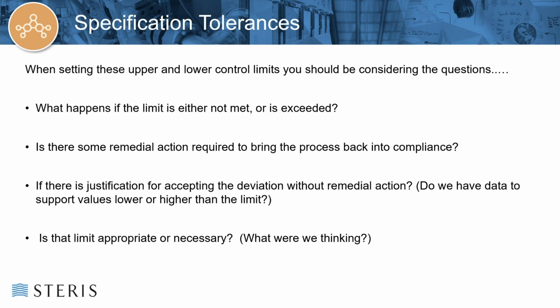Or do you have graphs that show if the product is cold, how long does it take it to heat up to the desired temperature before it can be removed? You want to make sure that your preconditioning timestamp was not exaggerated when you set the limit to start with. You want to make sure that you understand the minimum amount of time necessary for preconditioning, and then how much heat history can be delivered to your product before it affects the quality of the performance of the product by having additional heat added to it.